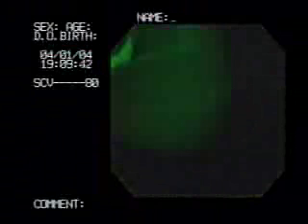The left lung is examined first. The main stem bronchus is examined. Next, the left upper lobe bronchus is examined and irrigated. And finally, the left lower lobe is examined and washed for cells.